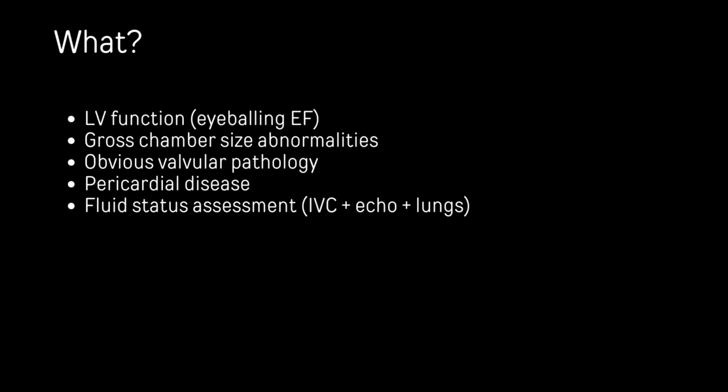Okay, but you need to put the probe on. And you're going to miss it with a stethoscope when there's a ventilator and you can't really hear what's going on. So pericardial disease, but really we're interested in pericardial effusion. But obviously with pericardial effusion, there's a difference between a clear pericardial effusion and then really fibrinous stranding, and I'll show you what it looks like when it's exudate.